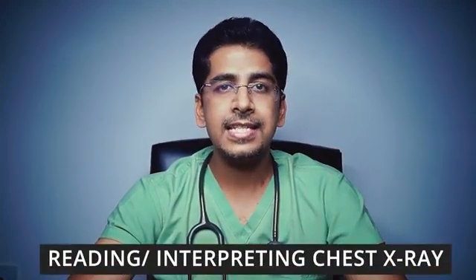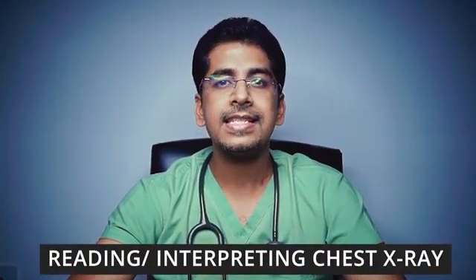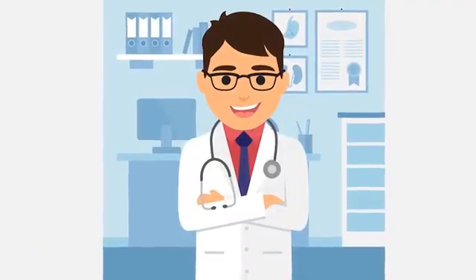This video is based on the request from all of you, from my juniors and my colleagues, and it is all about reading and interpreting X-rays in a simplified manner. In this video I have discussed around 25 X-rays, starting from the basics which you need to know. So do watch this video till the end to become a chest X-ray expert. So let's begin.